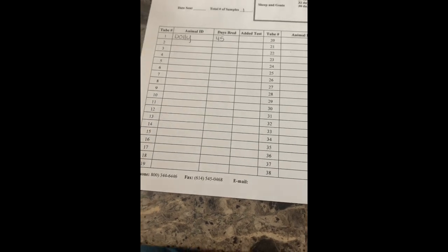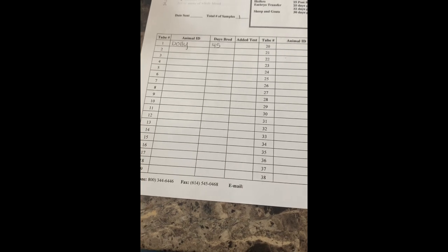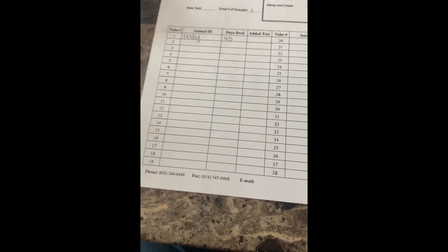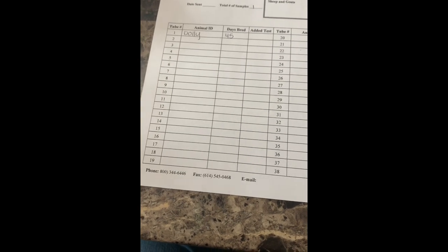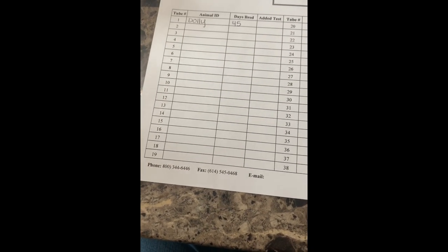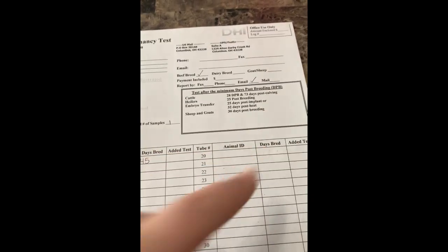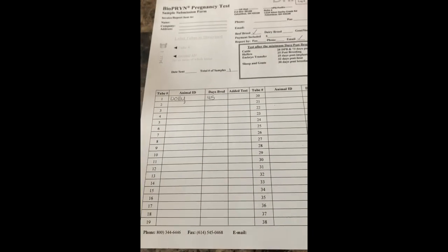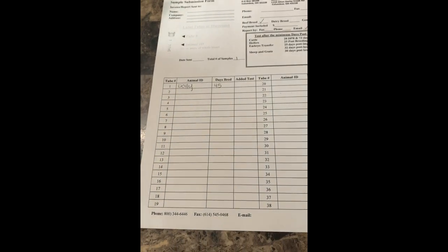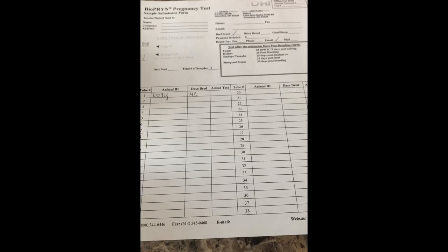And that's about it. Go ahead and get that shipped out — usually I get results within about a week. Once they have it at their facility, it's 24 hours and they'll let you know. You can get the report by fax, phone, or email. I always do email so I have it as a record. We're going to go ahead and ship this out and find out if we have a bred heifer. Thank you guys, have a great day.